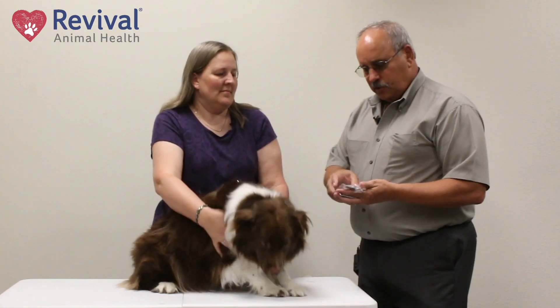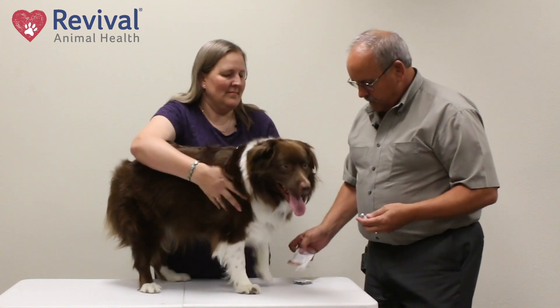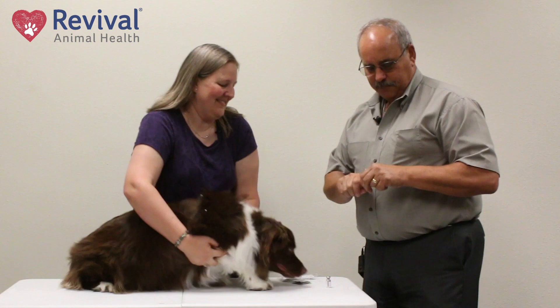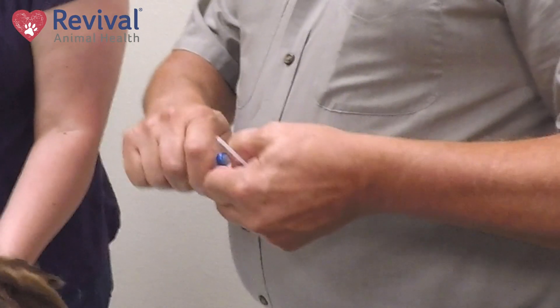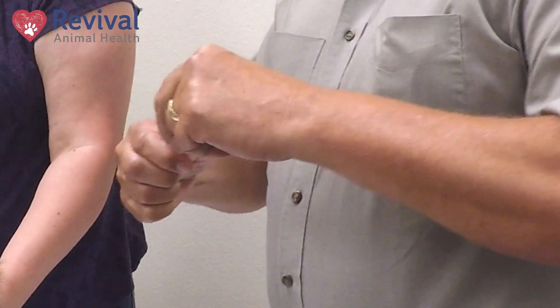We've got to mix this vaccine — it comes in a single dose pack, you just tear it out. You'll have sterile diluent, which is just sterile water, and you'll also have a powder that is nothing more than freeze-dried vaccine. It's a way to preserve that virus. All you're going to do is peel this vaccine down and open it up — you don't even need a syringe for this part.